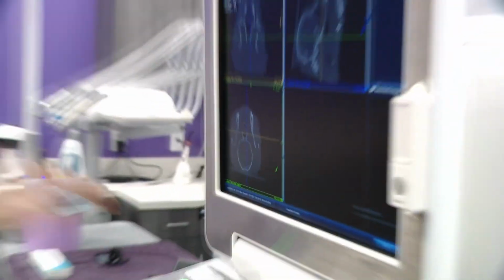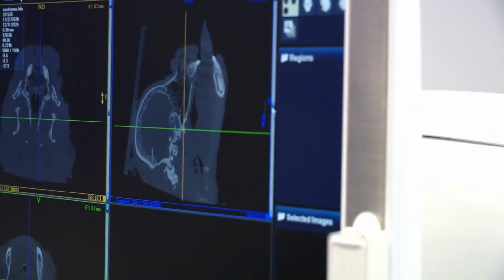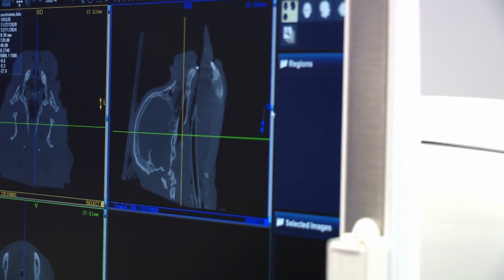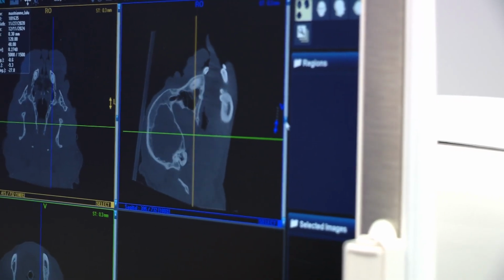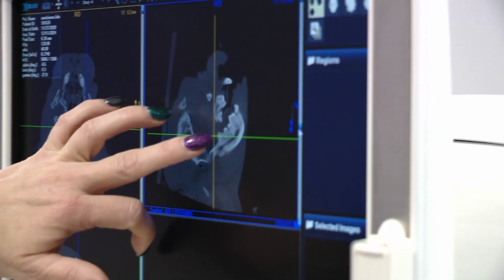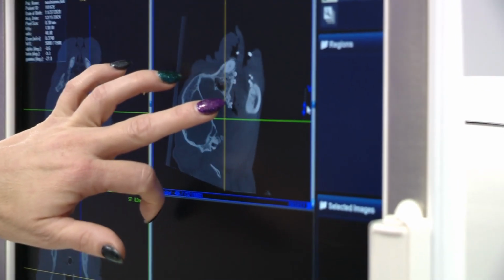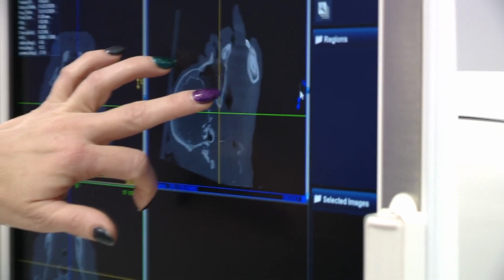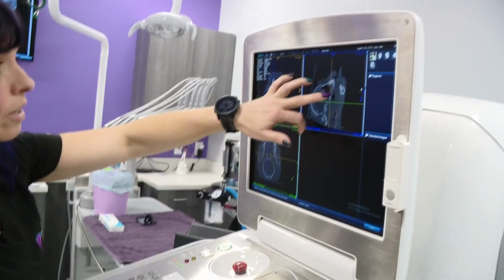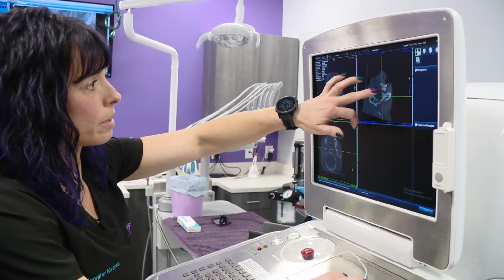And then we get the side-to-side view. So this is the traditional kind of view that we would get with regular X-ray, except we get multiple 0.3 millimeter slices, so we get a lot more of them on a side-to-side view, so we can really evaluate bone loss here. And again, for a Frenchie, this isn't really looking too bad, so might not have to have a lot of extractions today, just a really thorough, deep clean.